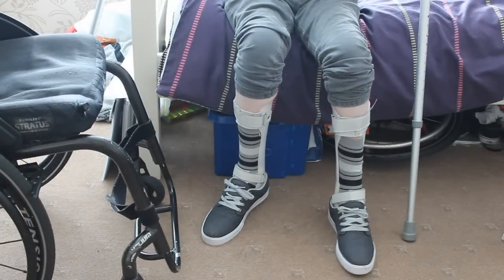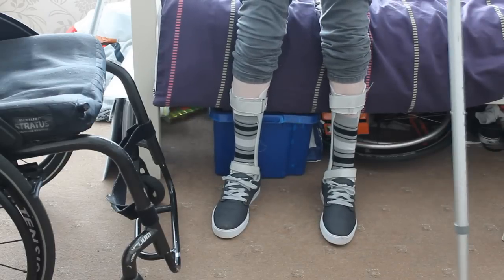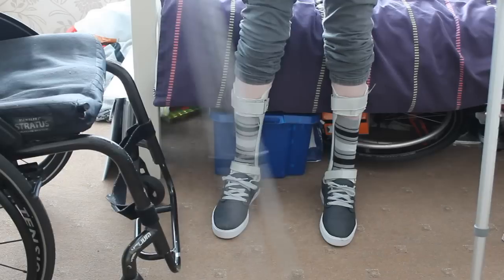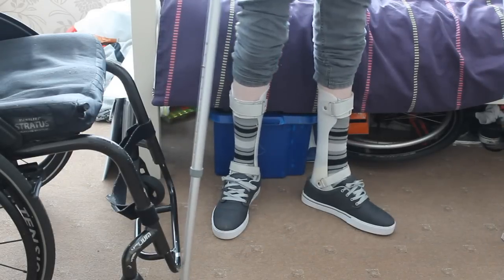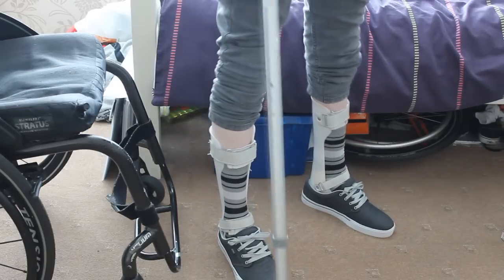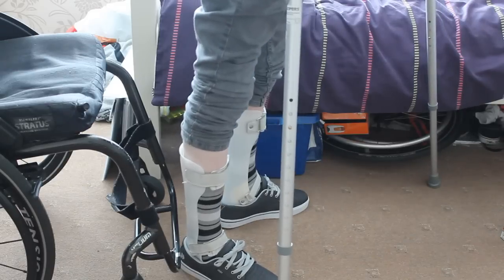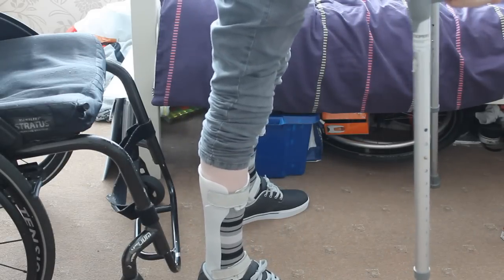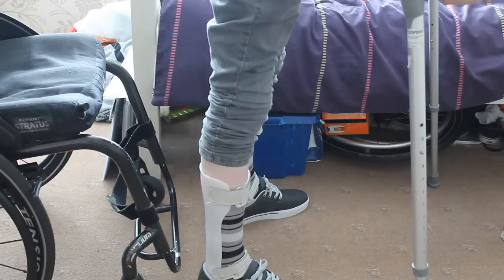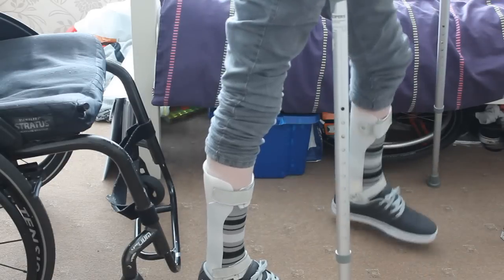I normally stand up with the crutches, so I'm going to stand up here. As you can see, the braces are supporting me. I've deliberately left the trouser leg up so you can see that brace there — it basically keeps the foot and everything in place and I can step around with them.